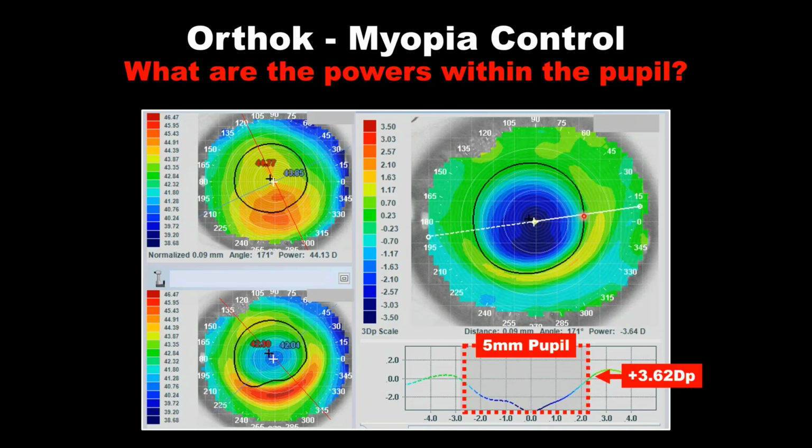So from this point to this point, we create essentially a 3 1/4 diopter add. Now, when you think about myopia control and what the experts are recommending to us, do they tell us in soft multifocal lenses to put a 1 add on the patient? The answer is absolutely not. Why would you push a tiny amount of plus?